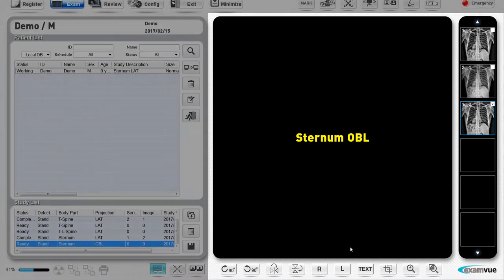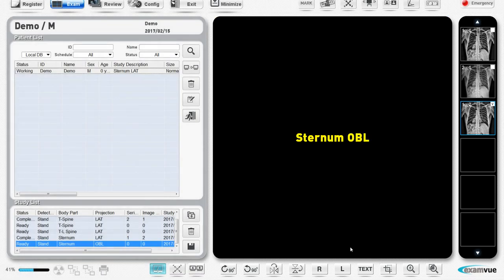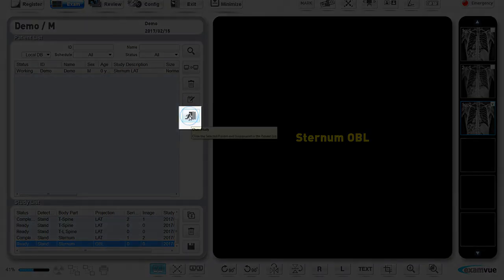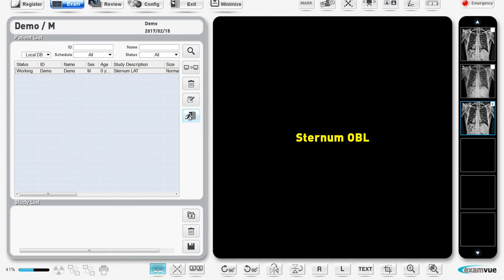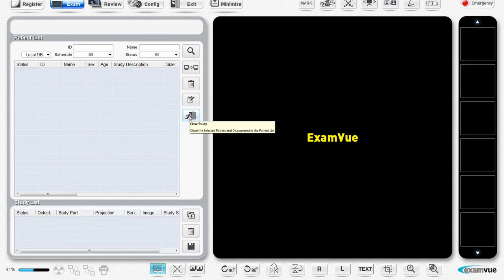Finally, you should always close the study by clicking the close study button. If you don't, the exam will remain on the exam window and will not be available to review or send to a DICOM destination. This finishes the registration and exam setup demonstration. On a different video, I will show you more in-depth the different tools you can use under the review window.